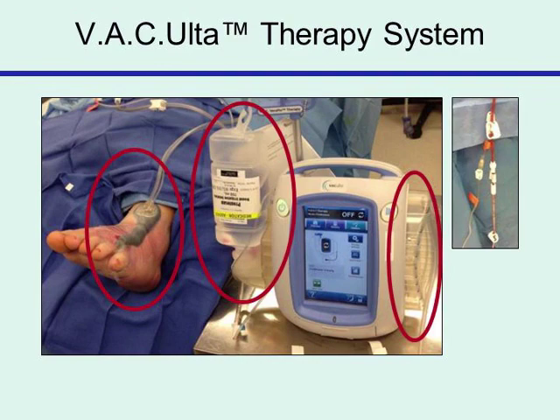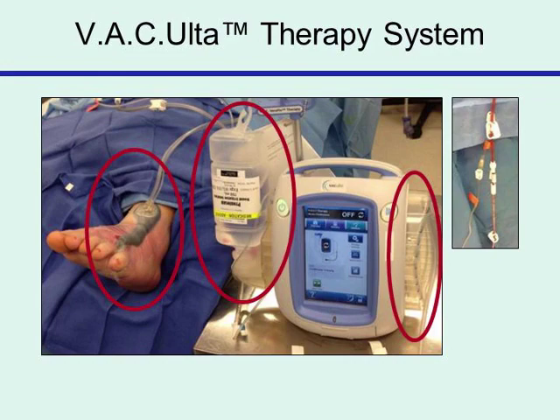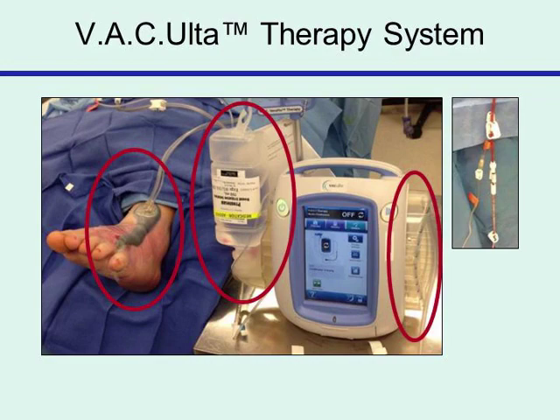A clinical example shows utilization of the VAC Ulta therapy system in the operating room. The tubing and cartridges are slightly different than using negative pressure therapy alone but have been made quite user-friendly. On the right side of the machine is the standard cartridge and collection for wound drainage and instillation fluids. In the center is the upside-down container with tubing connecting into the device, and on the left is the negative pressure dressing at the actual site of instillation, with both ingress and egress tubing.